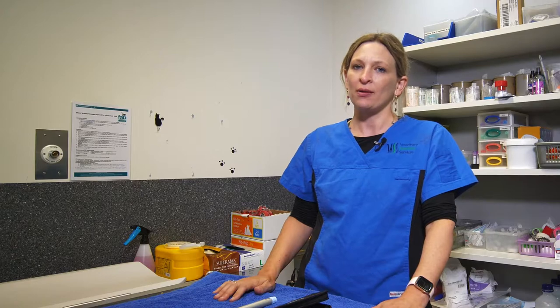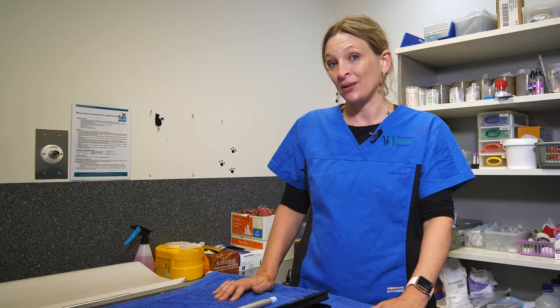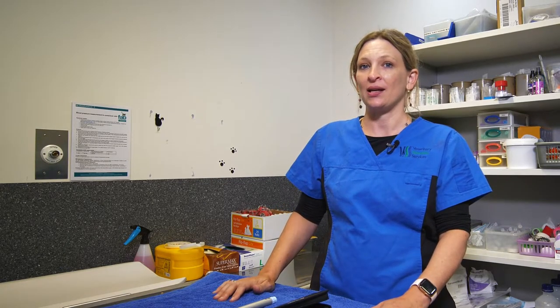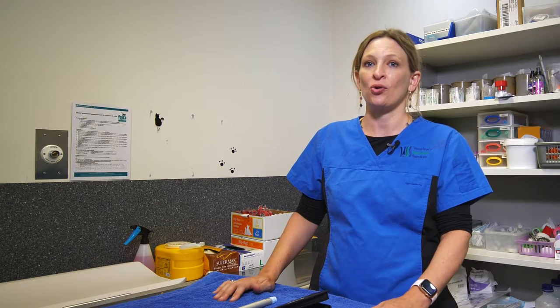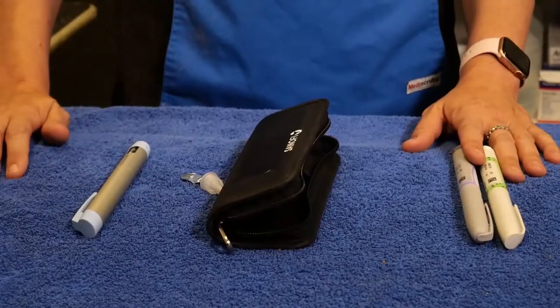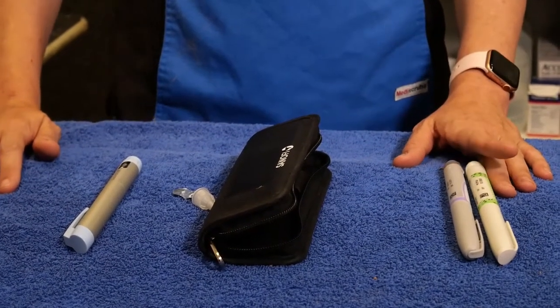We might have recommended the use of an insulin pen for you if your cat has been diagnosed as diabetic, and the benefit of using an insulin pen is that it gives us much greater control over much smaller doses of insulin that we might be using in diabetic patients.